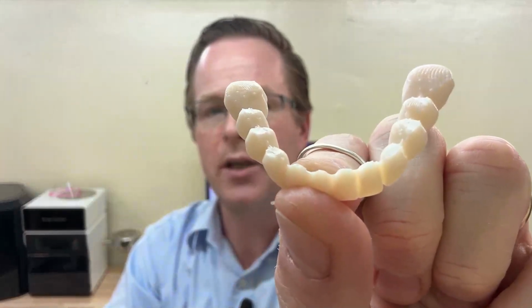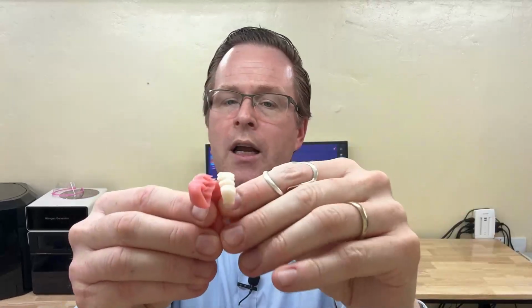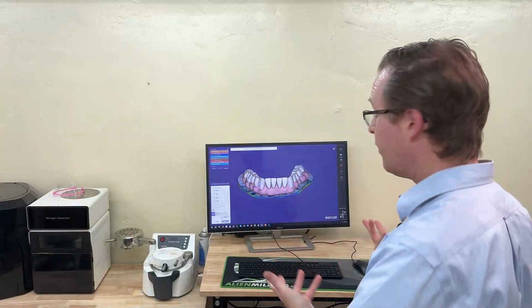And I haven't really done much post-processing on here. You can even see here I still have some supports on the edge of my 3D printed object. And this I printed on my Asiga 3D printer. However, it just depends upon what printer you have, because I've got this one right here I printed on my SprintRay printer. Very similar. I've got very little adjustments I made on here. Still some supports are on there. It just drops right into place. So let the computer think, and we'll go ahead and then pick back up once it's done.